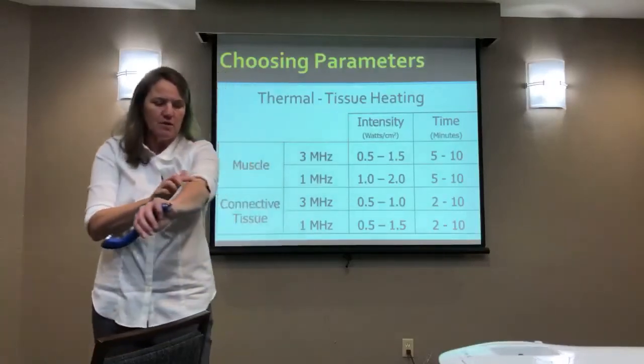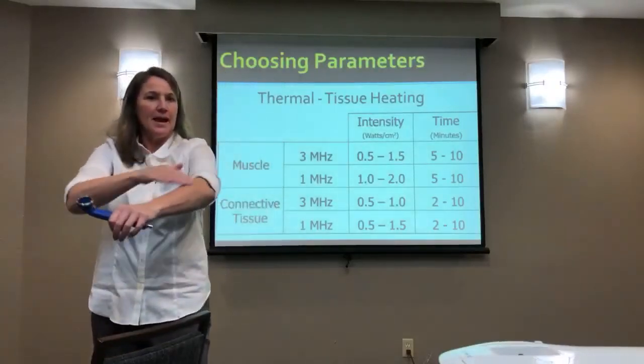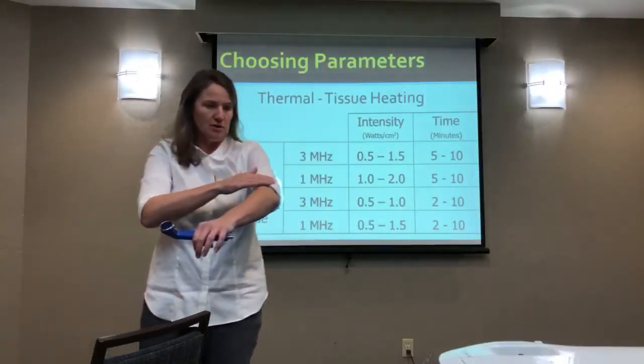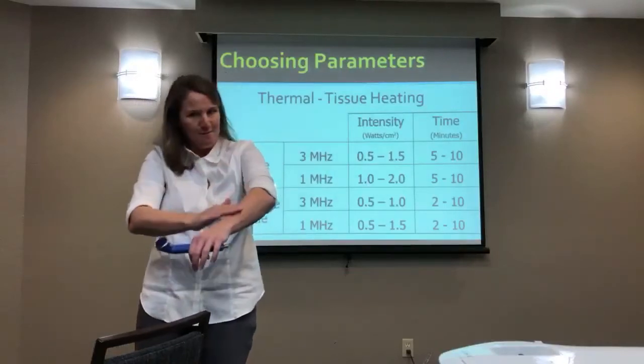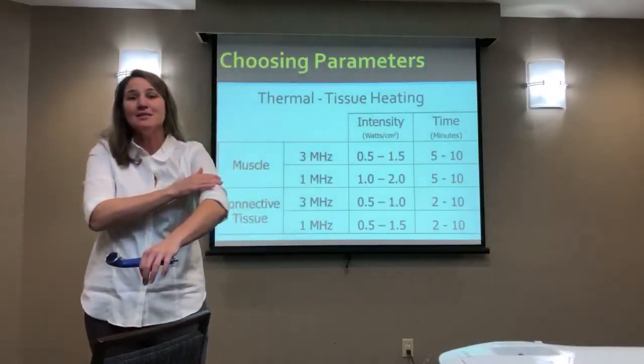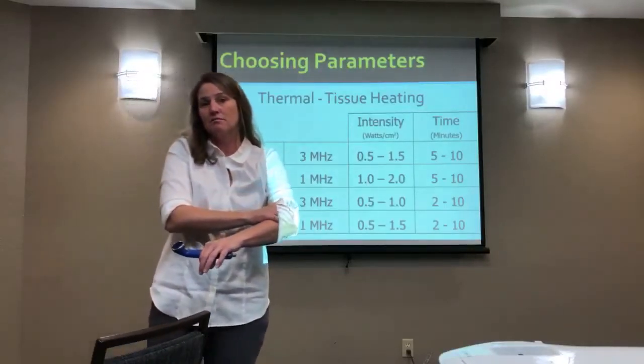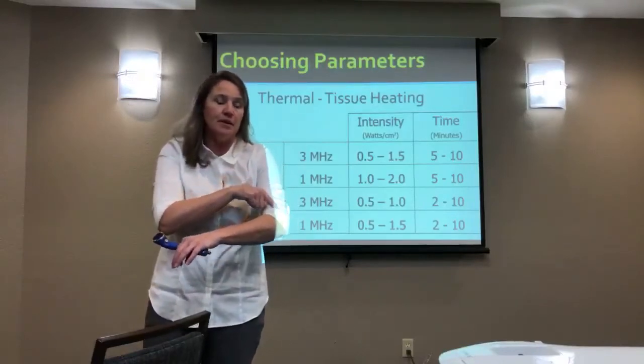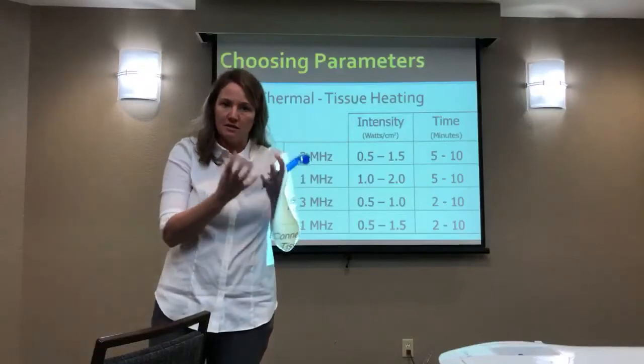Same within the arm, if you're moving up and down past the elbow, it might be way too big of a site, plus you're going superficial to deep, and it's impossible to expect your outcome to be half good, the same here as it would be here. It just can't happen. So I do think your target has to make sense.